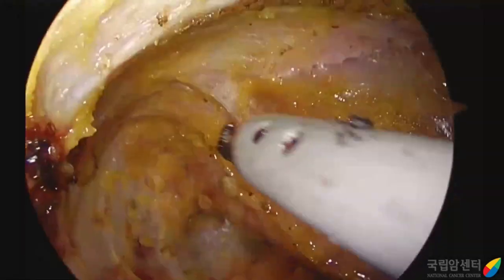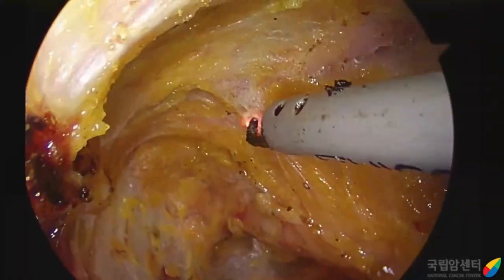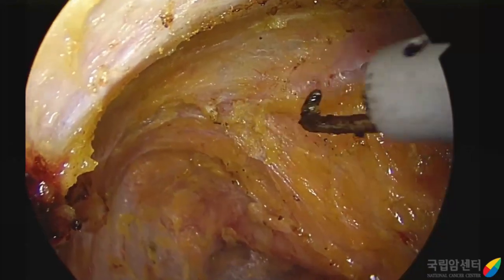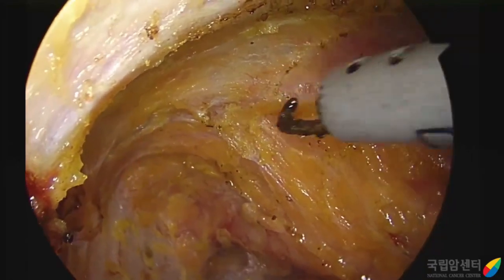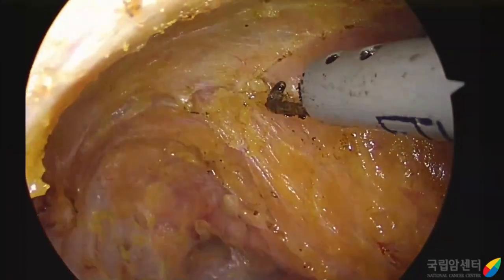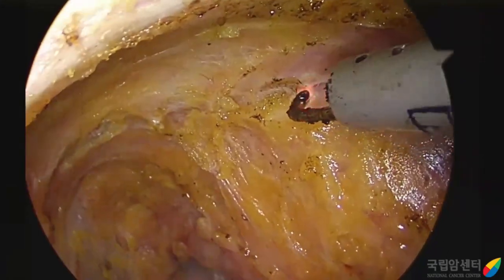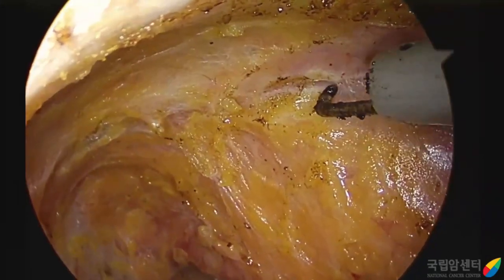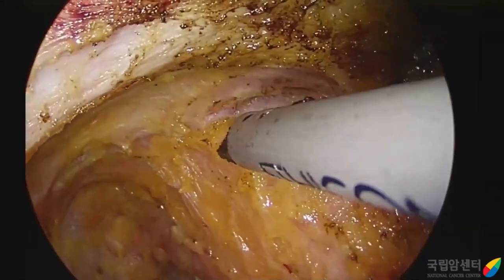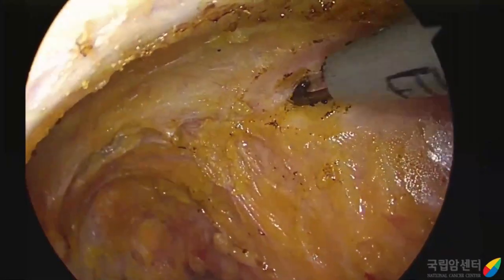When we proceed with dissection anteriorly, we can reach the peritoneal reflection and enter the peritoneal cavity.